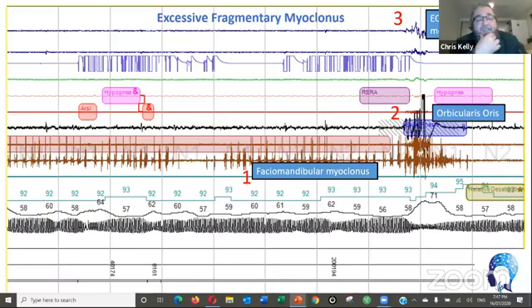You can see those constant high frequencies, high enough to be over and above the level you'd want to measure at to be able to measure it properly. But the consistency between the bursts is very consistent, like a marching band, and then it drops off and then it happens again. So in the first place, you've got myoclonus happening there. When I say trismus, people think lockjaw, but what I'm saying is it's just this juddery vibration in the muscles that's causing this facial tic thing.